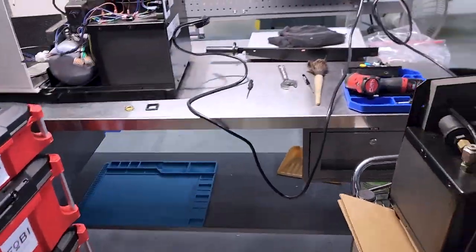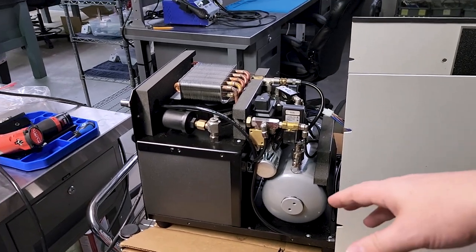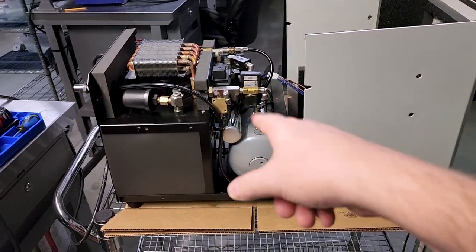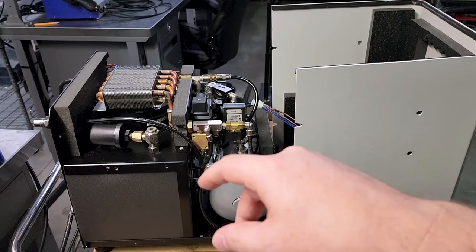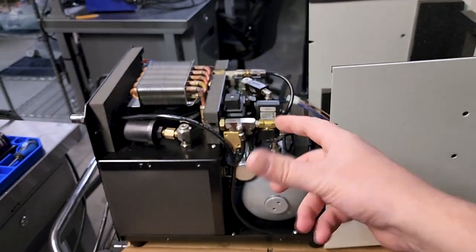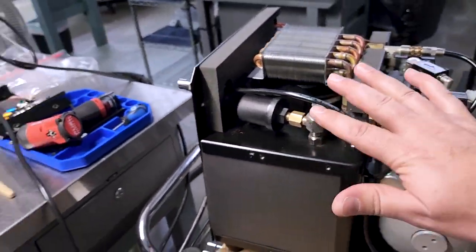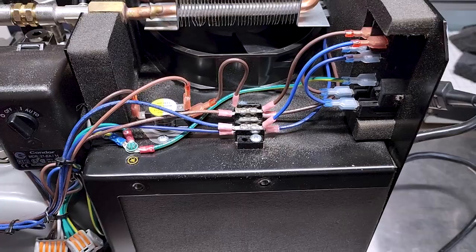Let's go take a look at this guy over here. Now this one, I honestly didn't see anything wrong with it. I will do some other checks on it just to be sure, but it should be a maintenance-free compressor. I believe so. I don't think that it's an oil compressor. It's probably maintenance-free, which means it's got like Teflon pistons. But this guy here sounds like it's okay. Now this one, yeah, she's a little dirty.